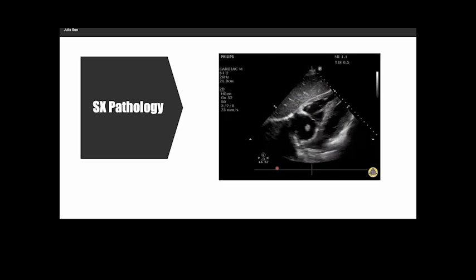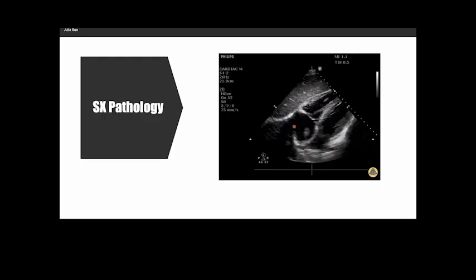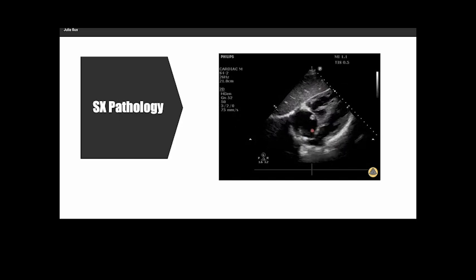All right, look right here. Look very closely. Again, you got the liver, the pericardium, okay? Right ventricle, left ventricle, right atrium, left atrium. What do you see? Look closely. What is that? There's something bouncing in the right heart, yeah? That doesn't look normal. So this is actually a clot in transit. So this is a blood clot, okay? And it's in the right atrium.